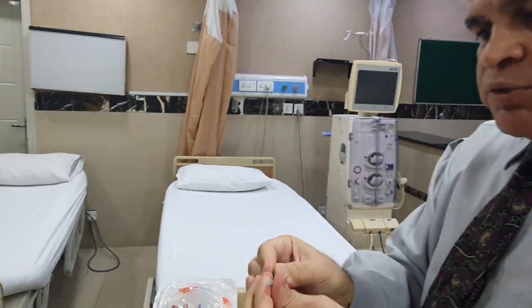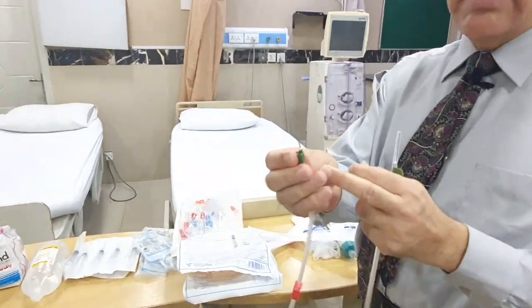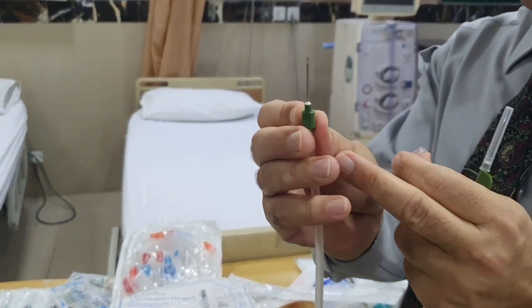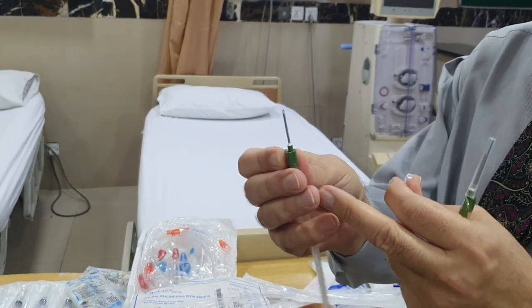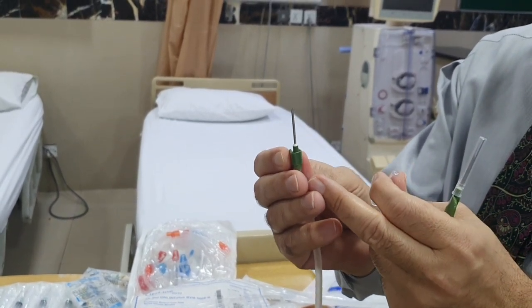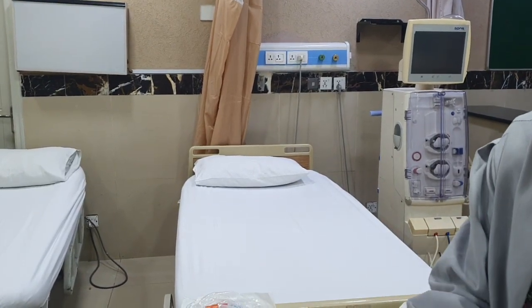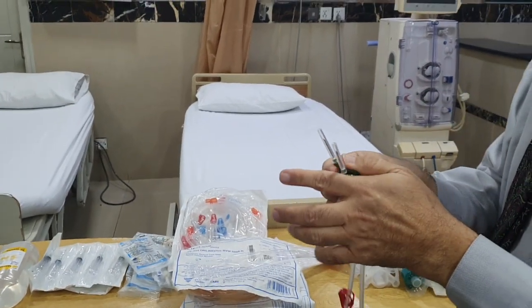Now, there is a huge difference when it comes to the bore. When you are using this particular needle, this will take on more blood. So this is the needle which you are going to take when you want to draw blood. If you use this on the other side, that means if you use it as a return needle, you're going to puncture, because the amount of blood going will be too great, and it is going to damage the blood vessel or the fistula. So if you get a needle which has a double bore, one at the back, one at the top, this is for drawing an excessive amount of blood, and this is better when you're drawing blood from the patient and going into the machine.